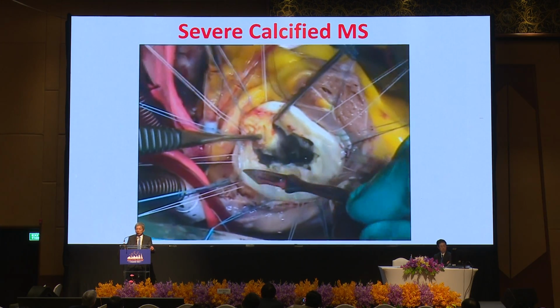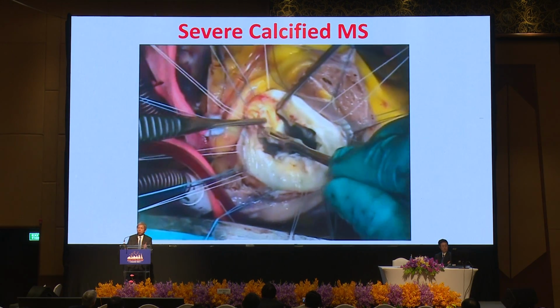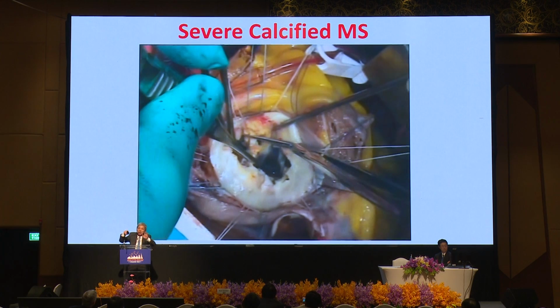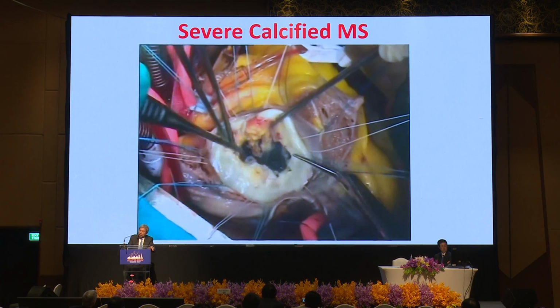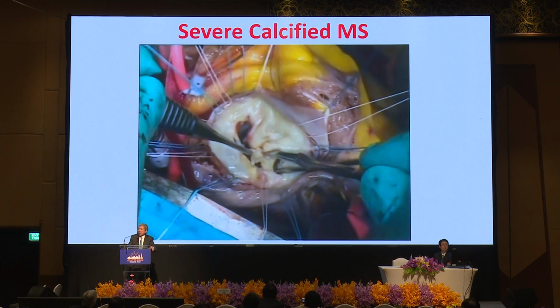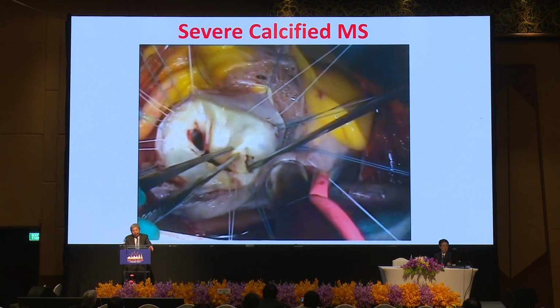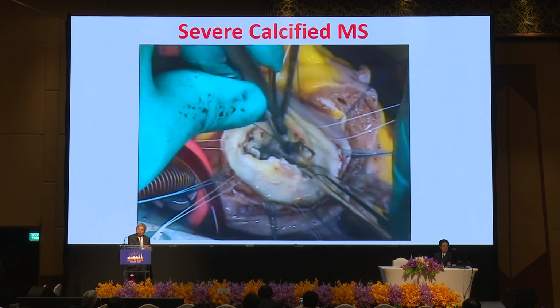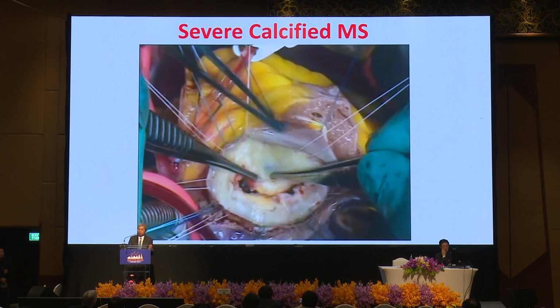And then, not just that, this fused fenestrated channel needs to be opened by fenestration. In this way, we can have the transverse movement and a better channel of flow during diastole. And all of these are carefully trimmed off, using sharp resection with the 15 blade. We finally can usually find the plane of this. And further using the fenestration plus papillotomy, we can improve the pliability of the leaflet and subvalve structure.